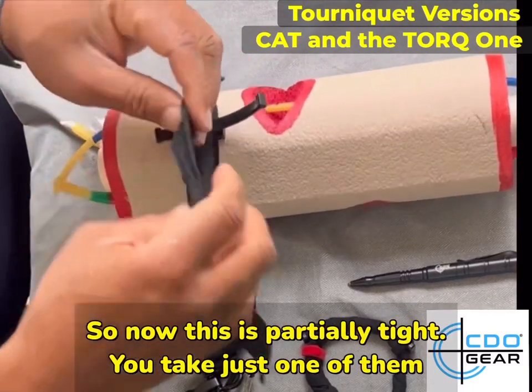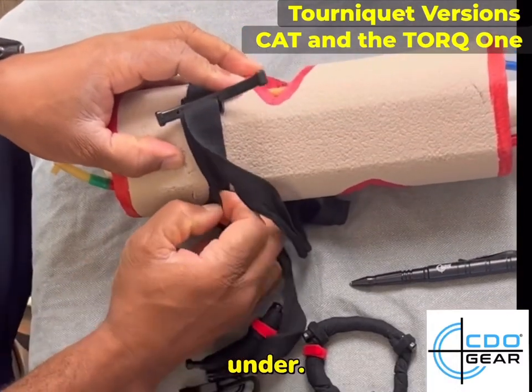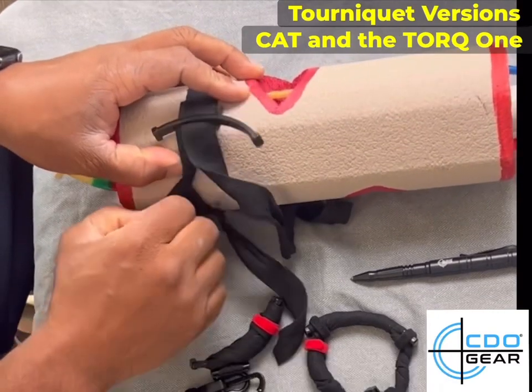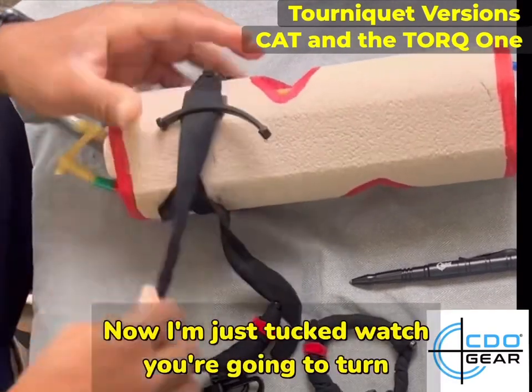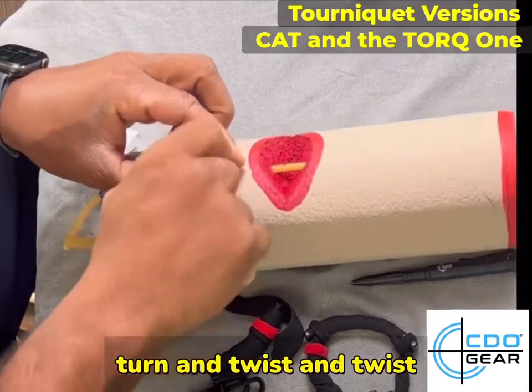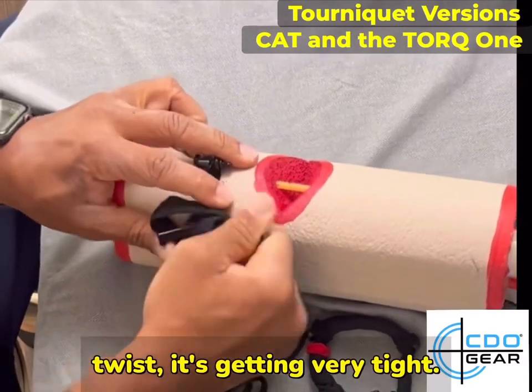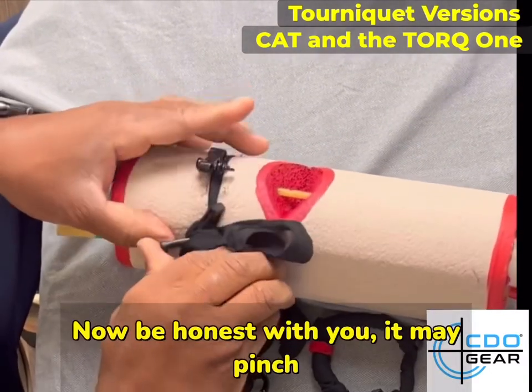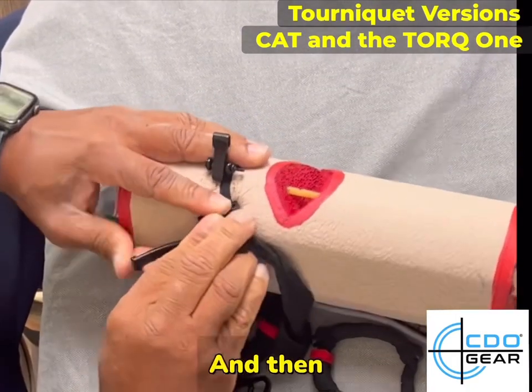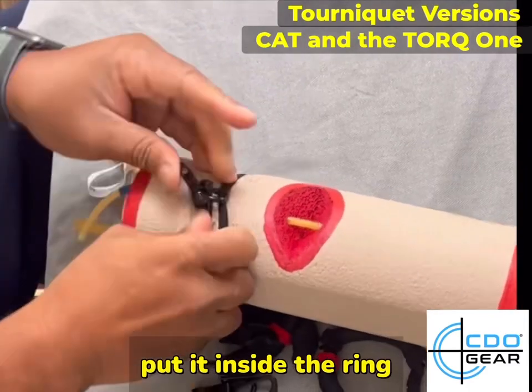So now this is partially tight. You take just one of them and you're going to tuck it under just like that — so it's tucked. Now you're going to turn it the same way: turn, and twist, and twist, and twist. It's getting very tight. I'll be honest with you, it may pinch. It's tight. And then put it inside the ring.